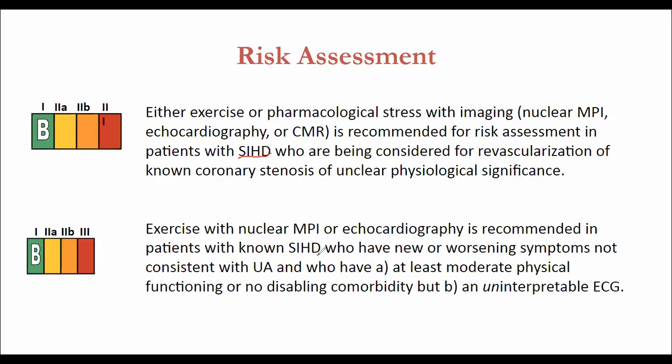And those with stable ischemic heart disease who have new or worsening symptoms, complaining that they were very good walking 15 minutes or 20 minutes and now started having symptoms at 10-15 minutes. So to know the ischemia burden in such patients, you can also use this MPS.